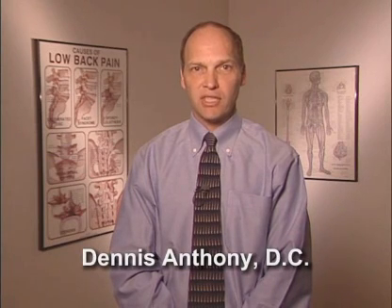The first words out of my mouth after an adjustment on a motorized flexion distraction table were, "That was an adjustment." I felt joints in my back move that have never moved before. After that adjustment, I knew I needed to purchase one of those tables and learn that technique. If that adjustment made me feel that good, I wanted my patients to feel that good.